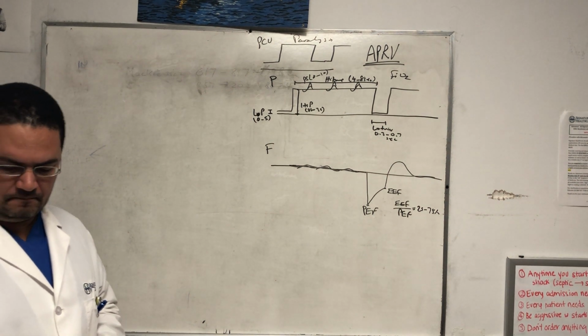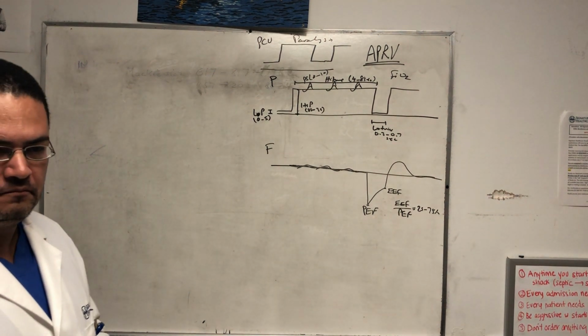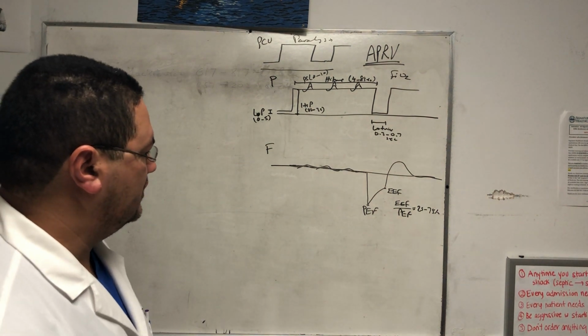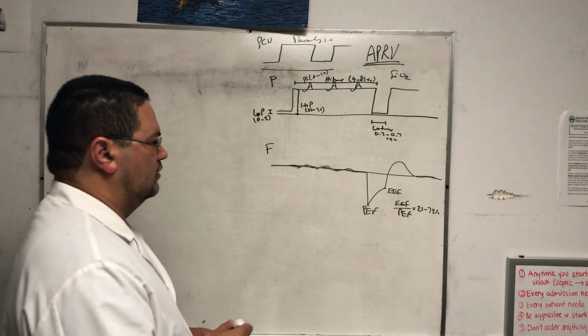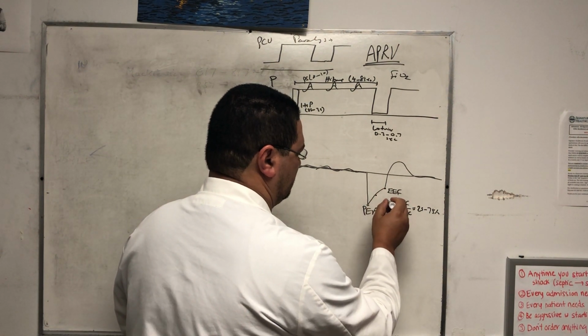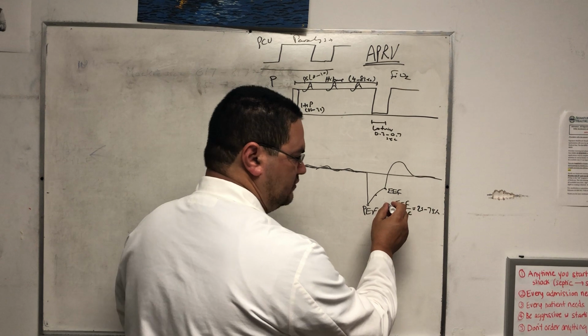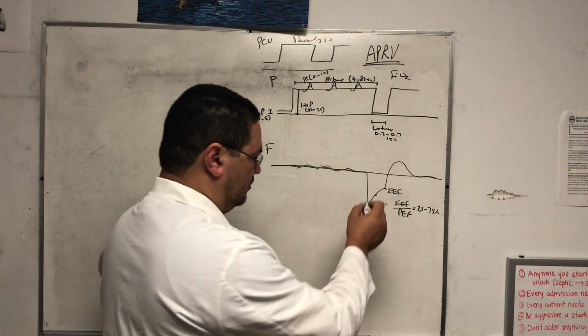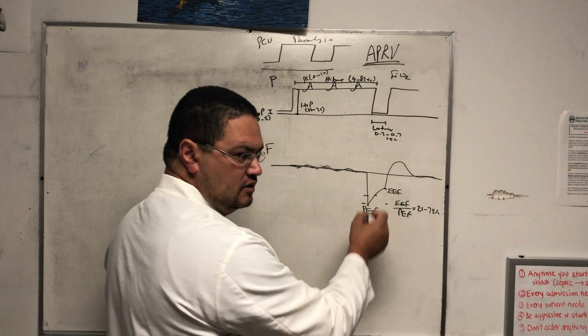So let's say the EEF to PEF ratio is 85%. What does that mean? That means that we finish the curve here, right? Because this is 75. This is like 50% of that. This is probably 85% of that, because they're close to each other, right? This and this.